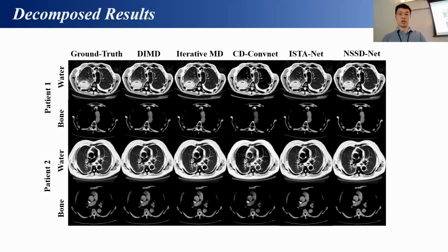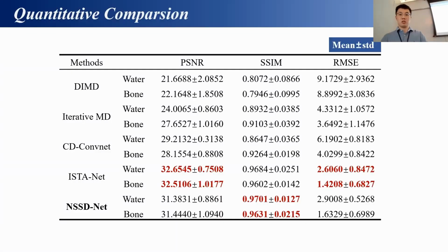So next, I will present some quantitative results. This work also calculates the PSNR, SSIM and RMSE for these two basis images. It can be observed that the proposed method can obtain quantitative results very close to the fully supervised method, such as the ISTANet here.